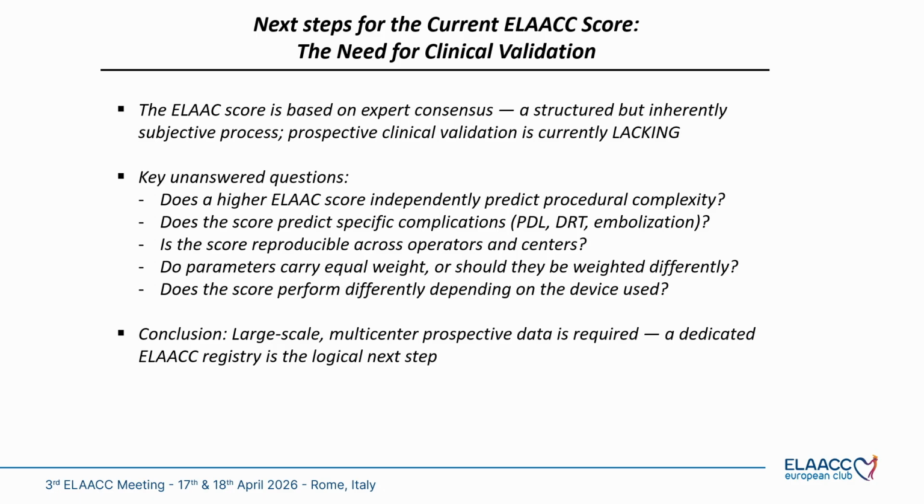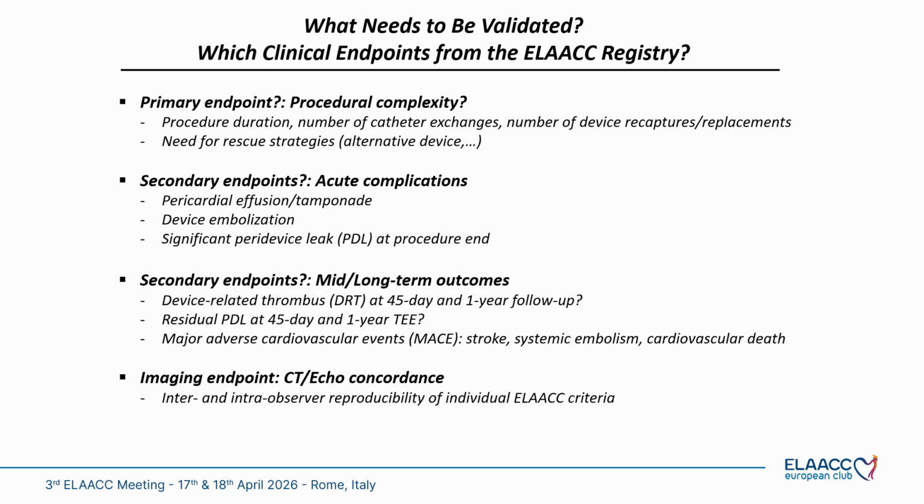Do some of the parameters carry equal weight, or should they be weighted differently? Does the score perform differently depending on the device used? These are a lot of questions that we still need to answer. And so we need large-scale, multi-center prospective data to address this problem.